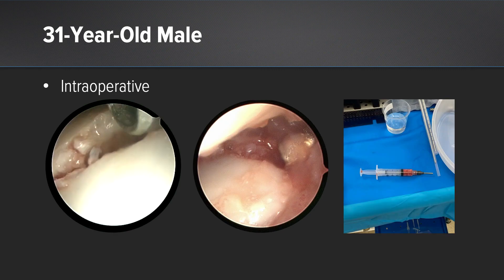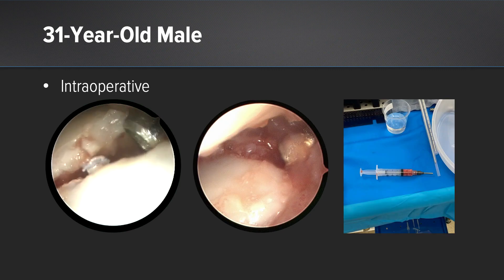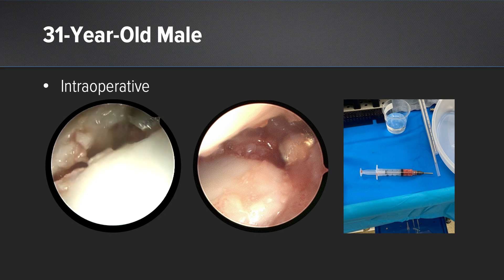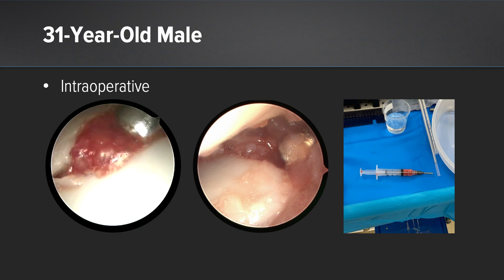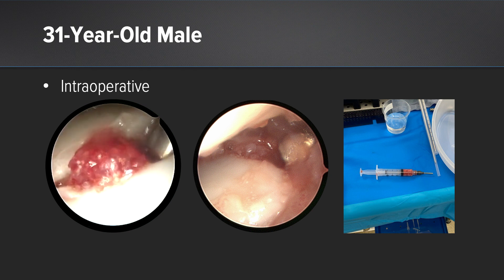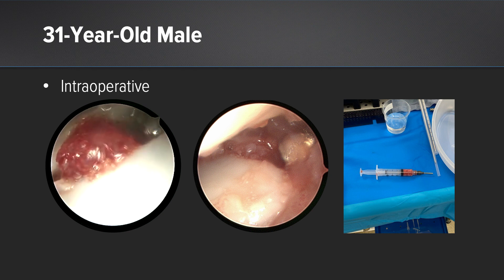Here is an intraoperative video showing insertion of the graft. First, we put the bone graft through a cannula, which is in the mid-carpal radial portal. The graft is inserted through a syringe into the non-union site. After adequately packing the non-union site, a blunt probe is then placed to pack the graft more volarly. The cannula is then reinserted and this is continued until the non-union site is fully packed with the bone graft.